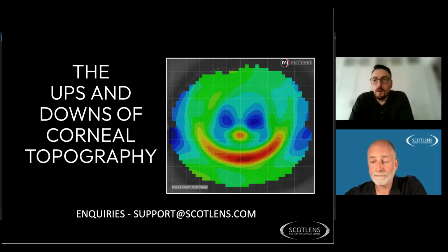Excellent, perfect. Is there a minimum diameter topography scan required for night lens fitting? No. We can design a lens very accurately just from Ks. What you need from the topography function is to be able to do that subtractive map. If you can do that, because it isolates the epithelial cells, which is what we're changing, then effectively your topographer is suitable for doing it. How good it is and how easy the maps are to interpret is a different story.